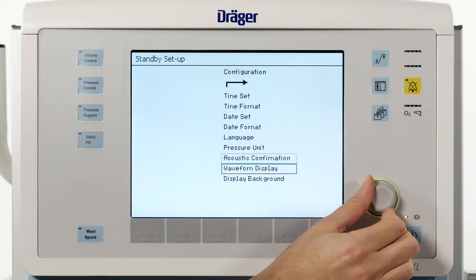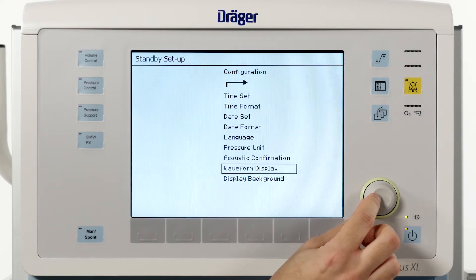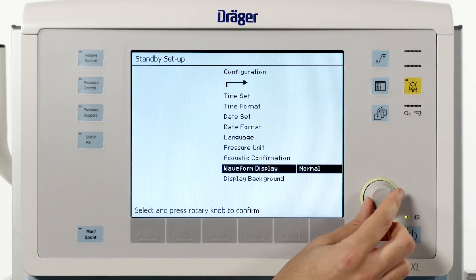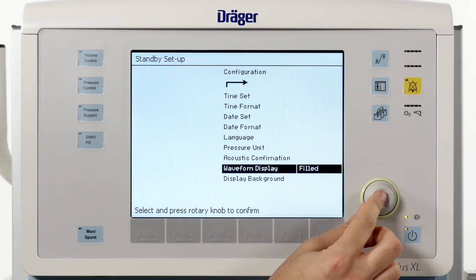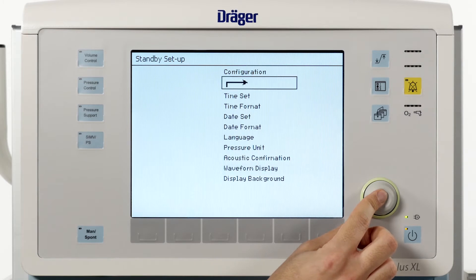The Fabius also allows you to change the layout of the pressure waveform. Under waveform display you can choose between a normal curve, which is a line, and a filled curve.